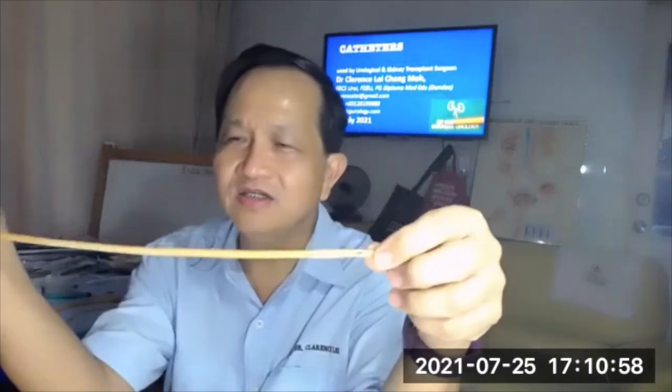The most important catheter — the workhorse catheter — is actually the Foley's catheter, usually size 14. It is a balloon catheter, meaning you can inflate a balloon and it will stay in the body, usually the urinary bladder. So the size 14 latex Foley's catheter is the workhorse catheter for urological practice.